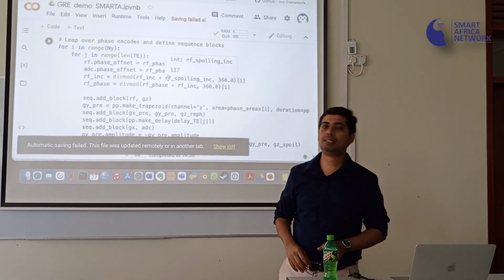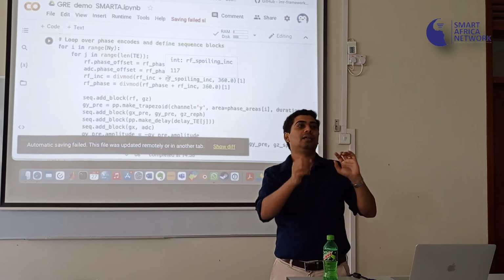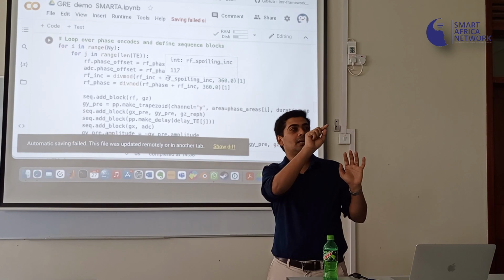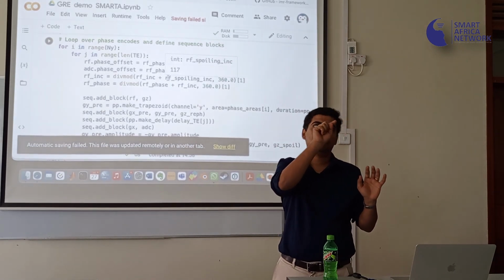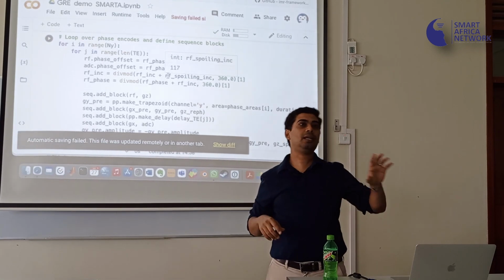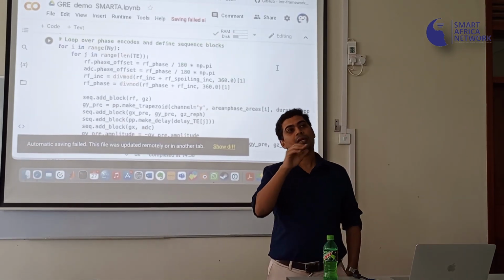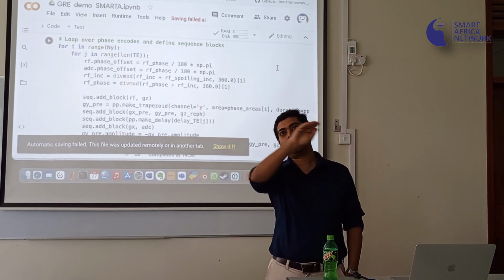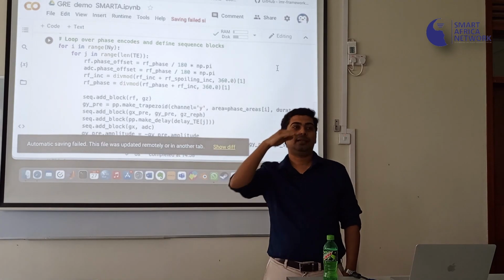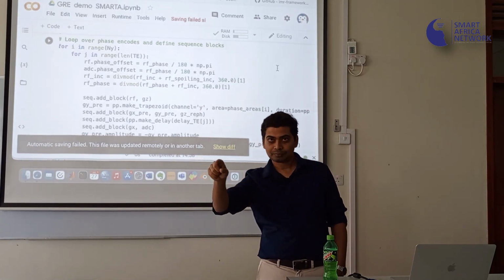What this is trying to say is, I need a 2D grid, right? Like when you take a picture, the photons keep coming in, let's say in raster fashion, like a dot matrix printer goes blip, blip, blip, blip, and then goes to the next row. Similarly, here you also need to cover 2 dimensions. The first one is called the readout, which happens at 10 microseconds each. And then you step, go to the next one, and acquire again.